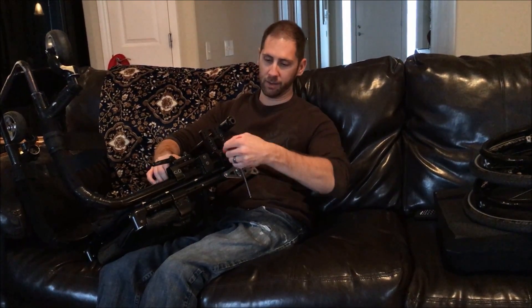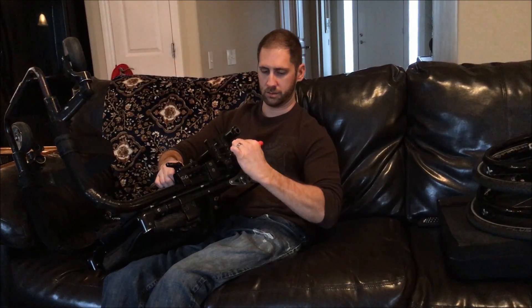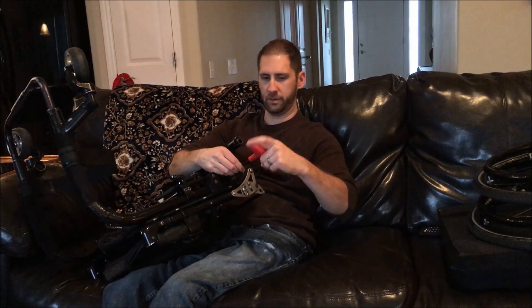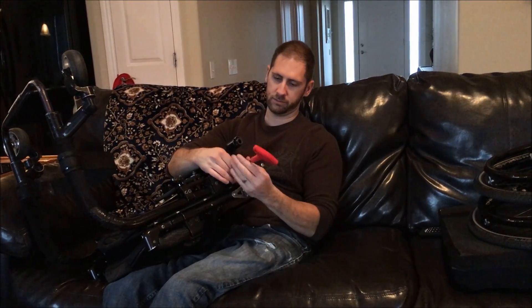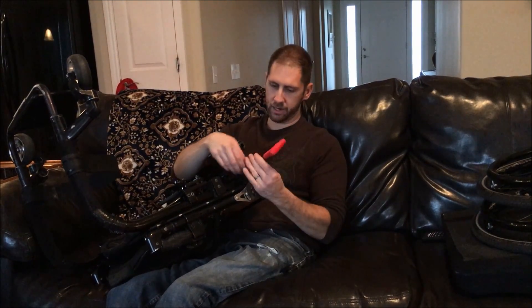So we'll go ahead and loosen these up — I'm just going to break these loose on both sides. And then you can use the other end just to kind of spin them off, which is pretty nice. Comes off fairly fast. I did the same thing with the one back here.